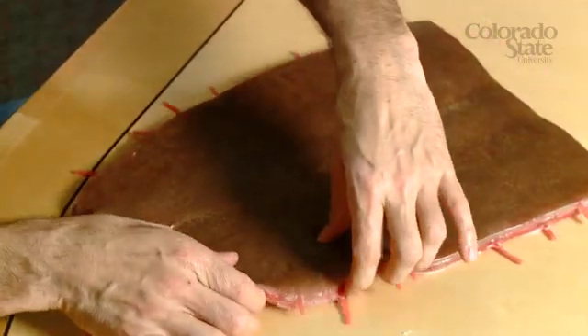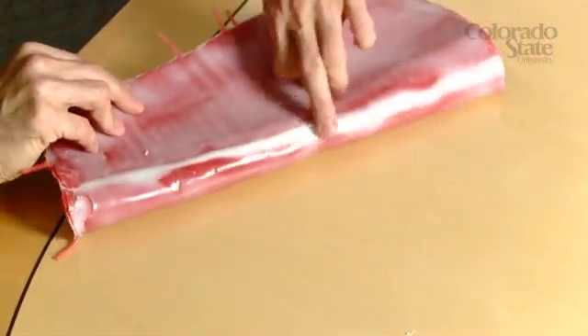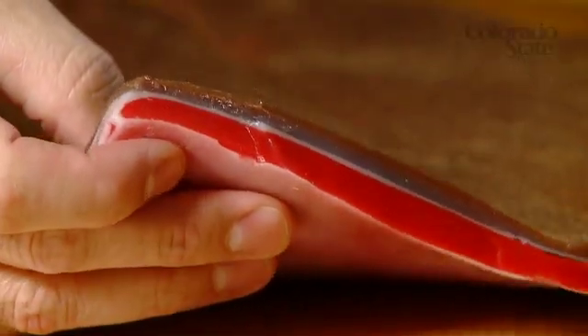What we've done here, creating this model, was to put together different layers of silicone with different formulations and different consistencies. We made this model initially based on the original organic tissue of the horse, and we made a model from this animal's ventral abdominal wall. So here you can see all the layers that we created with this model.